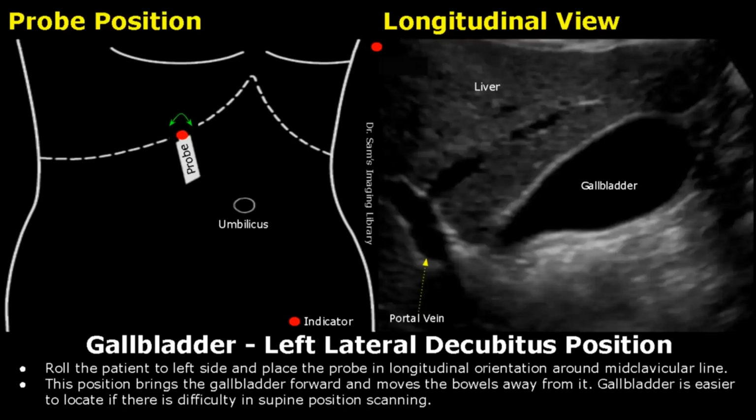An erect patient position is also used in some cases with the same probe placements.